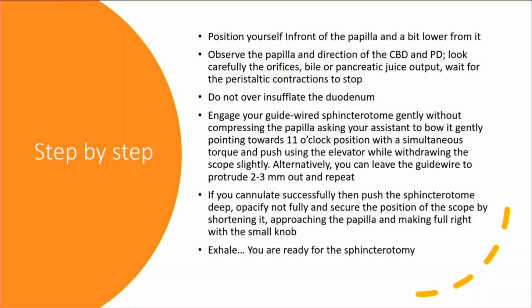This may be helpful, and sometimes you need to stop doing anything because there are intense contractions. Of course, you can give an antispasmodic medicine to help, but sometimes you will be able to identify the orifice of the papilla. You can see some bile coming out, and this may help you to understand which direction you have to go to.